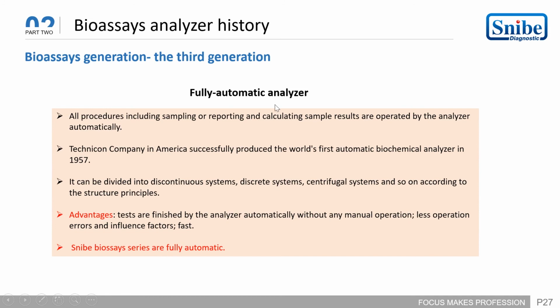The third generation, fully automatic analyzer. All procedures, including sampling or reporting and calculating sample results, are operated by the analyzer automatically. Technicon company in America successfully produced the world's first automatic biochemical analyzer.